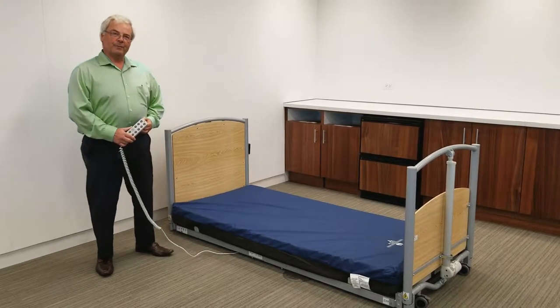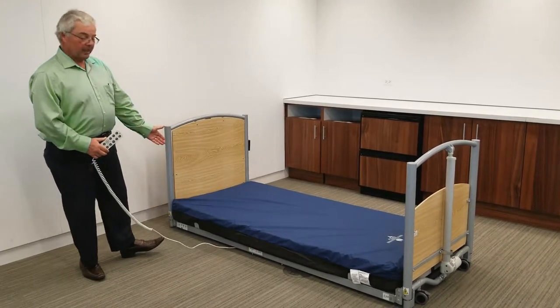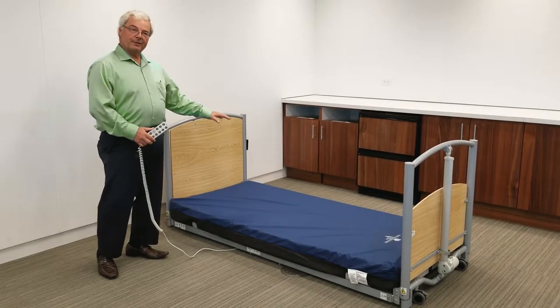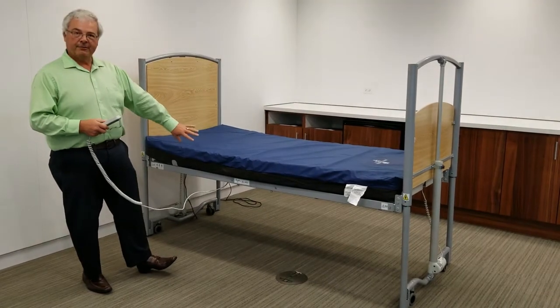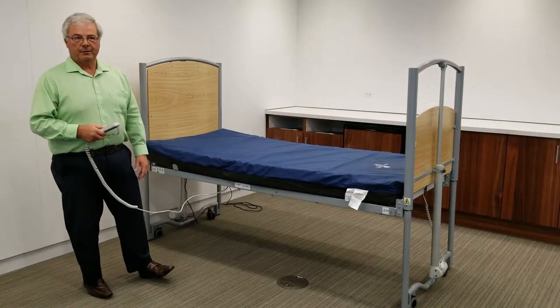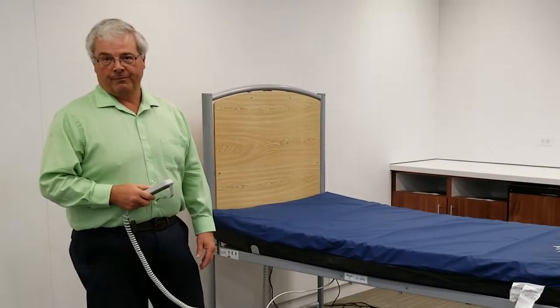Hi, I'm Steve Rankis, a registered nurse from Acora. A true bed for all, the floor bed goes to floor level to help prevent fall injury, rises to full height for standard nursing care, and is a full five-function bed. This is a 36-inch model. We also have a 42-inch model. The 36-inch will hold 330-pound patient weight and the 42-inch will hold 500 pounds.